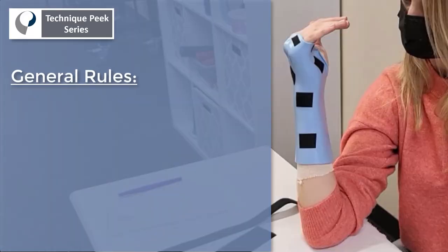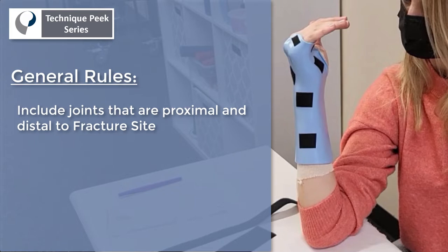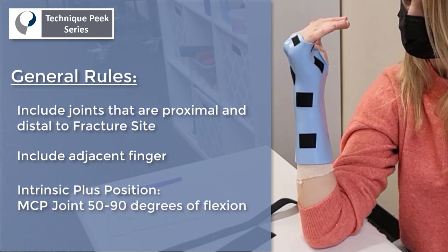The general rule of thumb for fabrication of an ulnar gutter splint is to include the joints proximal and distal to the fracture site, including the adjacent finger to the fractured finger, and putting the patient in that intrinsic plus position at 50 to 90 degrees of MCP joint flexion. Obviously, different physicians have different preferences, so first and foremost, follow what's on the prescription.